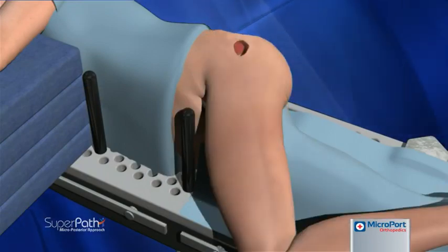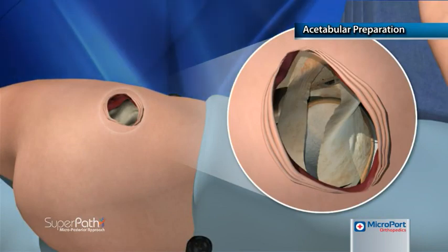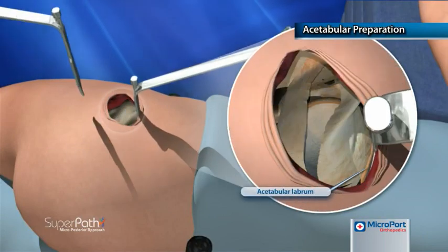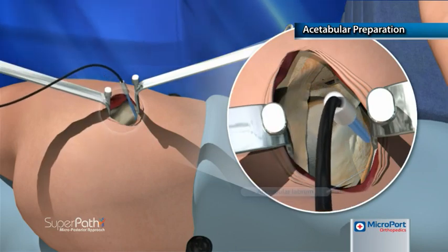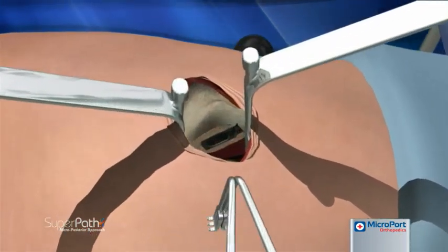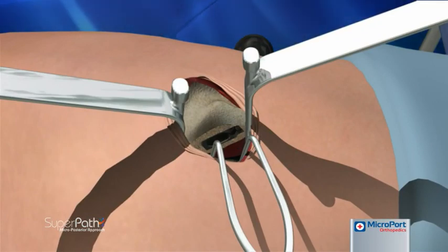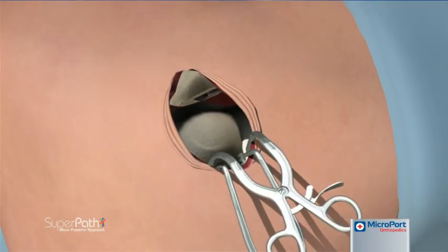With the operative leg returned to the original patient position, acetabular preparation begins. Two spiked Hohmanns are placed at the anterior and posterior sides of the acetabulum into the axilla between the capsule and the labrum. The labrum is removed, as well as any remaining tissue from the acetabulum. A Zelpi retractor is placed subperiosteally at the acetabular margin at the proximal wound, and a Romanelli retractor is placed immediately distal. The combination of these retractors provides rotational stability, after which the spiked Hohmann retractors are removed.